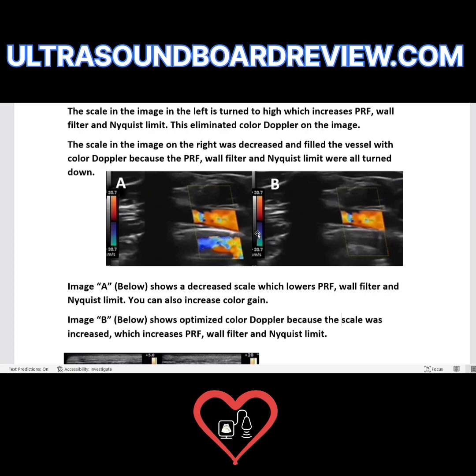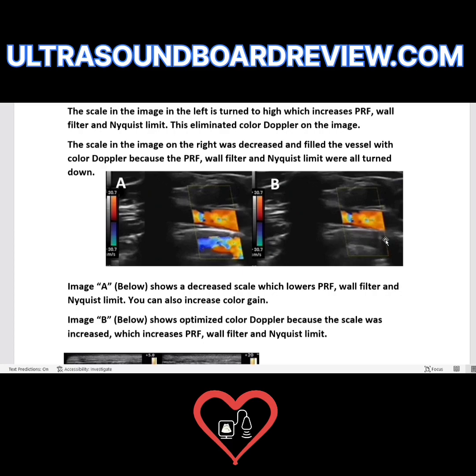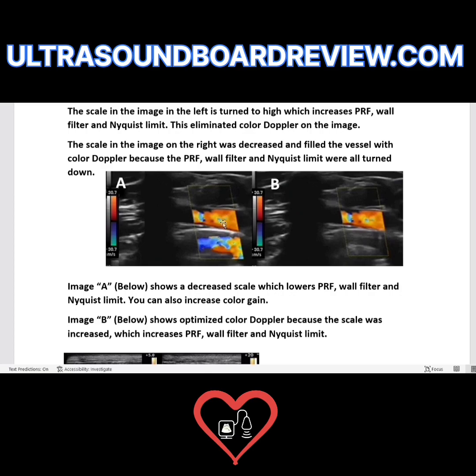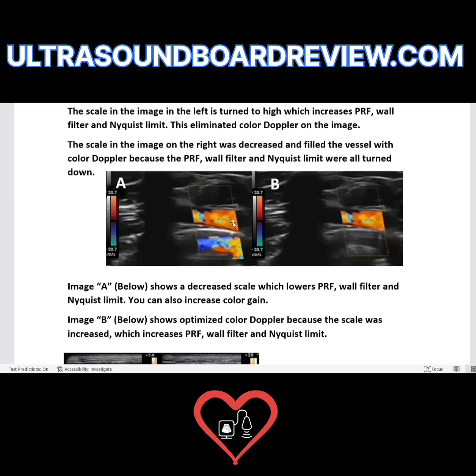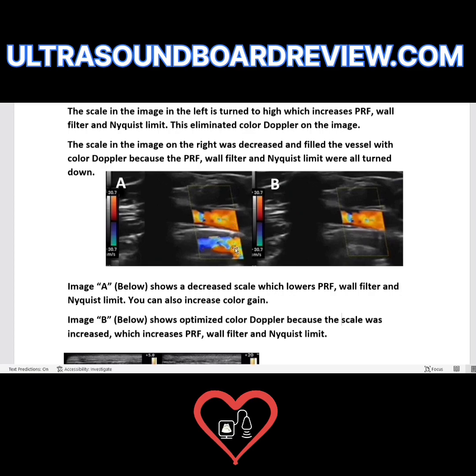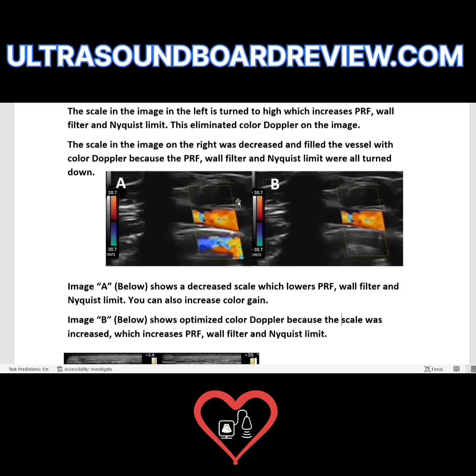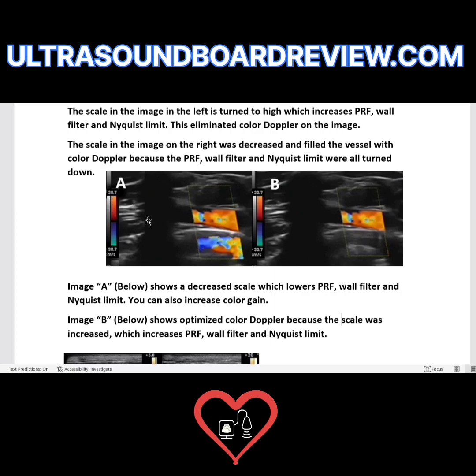But this patient has a color Doppler mirror artifact. Image A shows color Doppler in the true subclavian artery and in the color mirror Doppler artifact. When you look at the scales, they're the same.